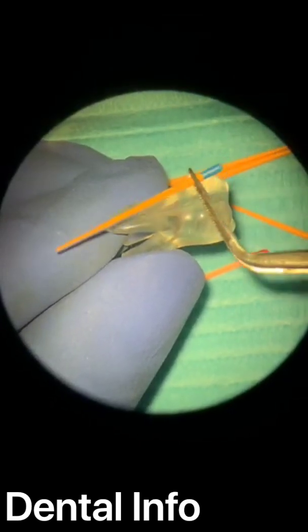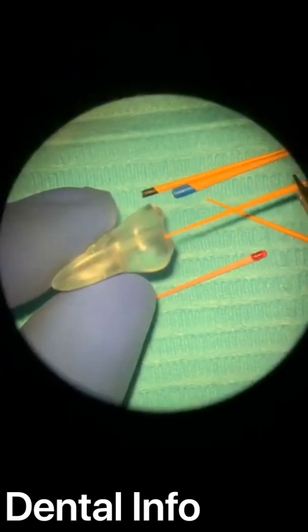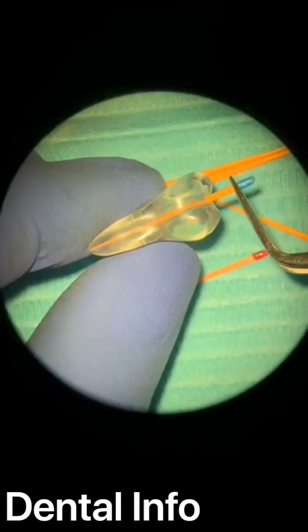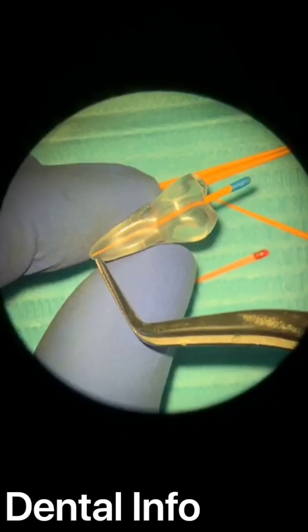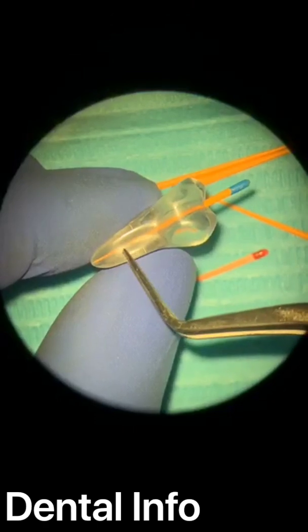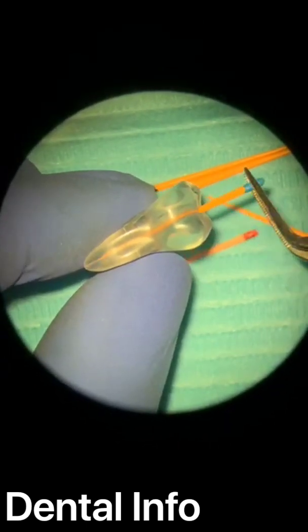After this lecture, I think you will be more precise about tugback and you will change your mind about it. I am taking the 3004 now with no adaptation of the tip. I didn't cut the tip or do anything here, and I will insert it. See? The same as the 2504, it goes to the end. But I have tugback, though I don't like it. I am sure that I am gaining this tugback apically, not in the middle part or the coronal part. Why? Because I have less taper, and it goes to the apex like the 25. So two cones go to the end.